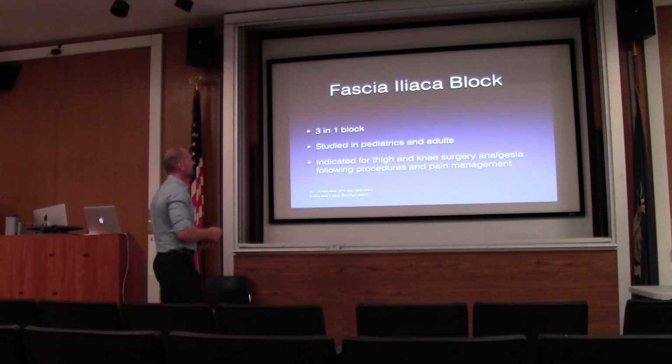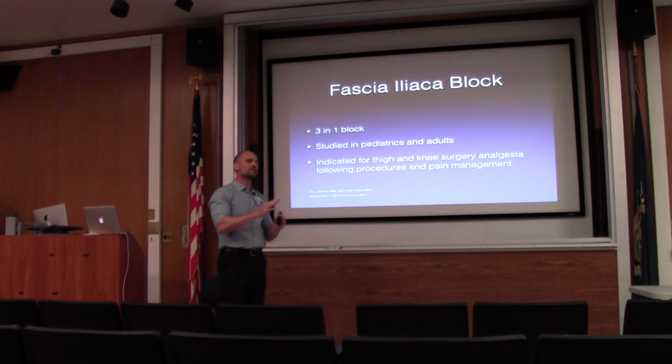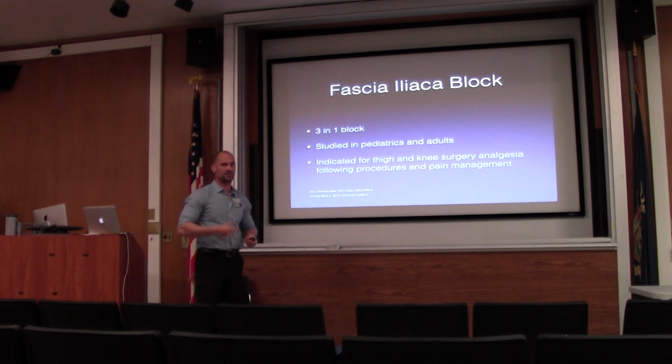It's indicated for a lot of different procedures, and essentially what I want you guys to understand is that we're going off into the realm of pain management and regional guided anesthesia, and so we talk about it as if this has been ours for a long time. This is actually stuff that's been done by anesthesia for a long time, and we're basically taking bits and pieces of their procedures and applying them to our own patients.